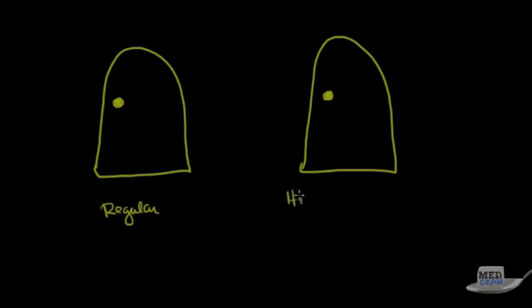Let's pretend this is your lung. Kind of looks like a Pac-Man ghost, but nonetheless. And here's our little nodule right here in the lung. And you've got a choice. You can do a regular CT scan, or we can do a high res CT scan, otherwise known as an HRCT. Okay, so which one is going to be the best way to go? Well, first of all, we got to know about how they do these things.